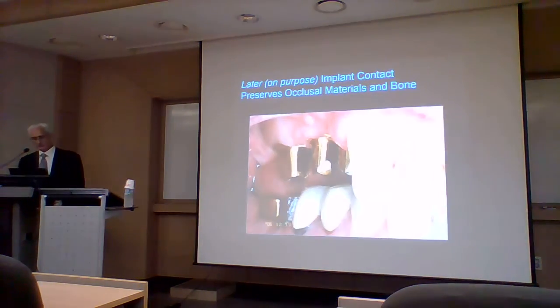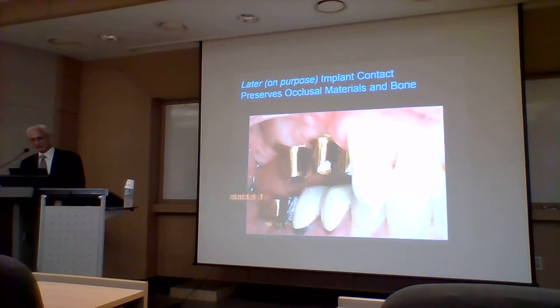So time delay is where you have the front teeth strike first and the implants make contact fractions of seconds later.